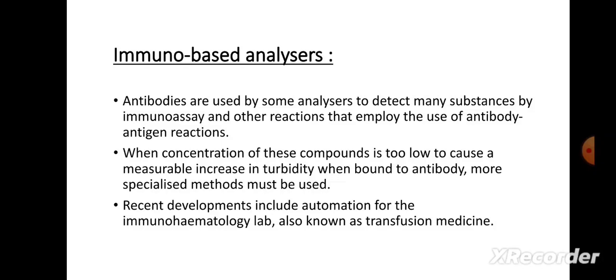Next, when the concentration of a compound is too low to cause a measurable increase in turbidity when bound to antibody, more specialized methods must be used. Recent developments include automation for the immunohematology lab, also known as the transfusion lab.